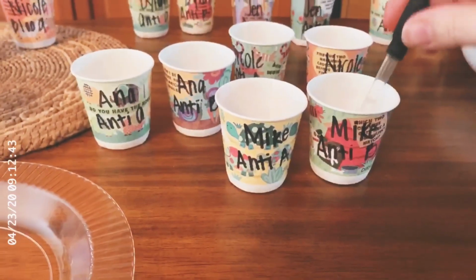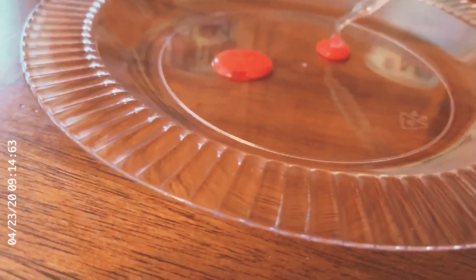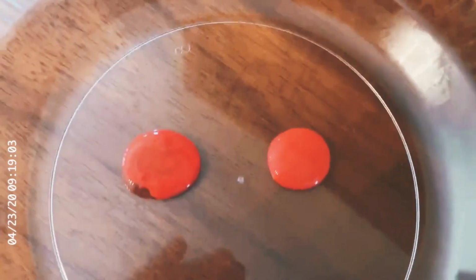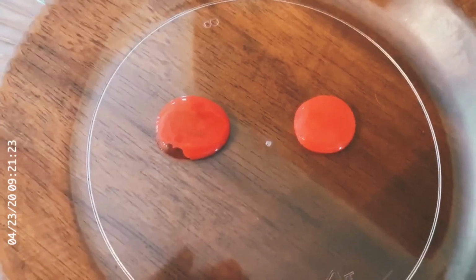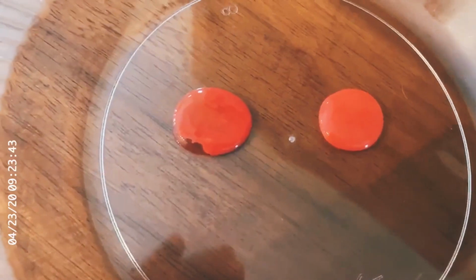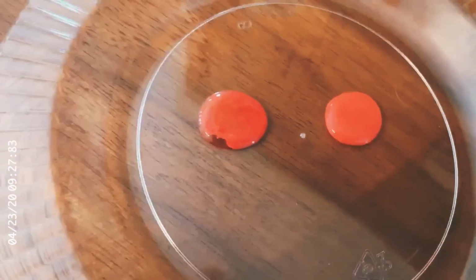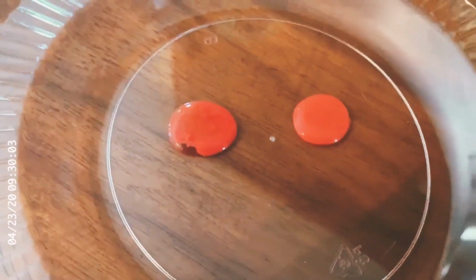Then anti-serum B for Mike. And I'm going to go ahead and drop it in his second one. And we're going to look to see what's going on for Mike. If it clots, it's positive. If it doesn't clot, it's negative. Go ahead and write down the data for Mike.